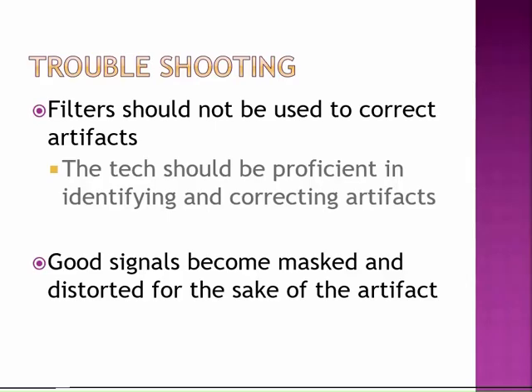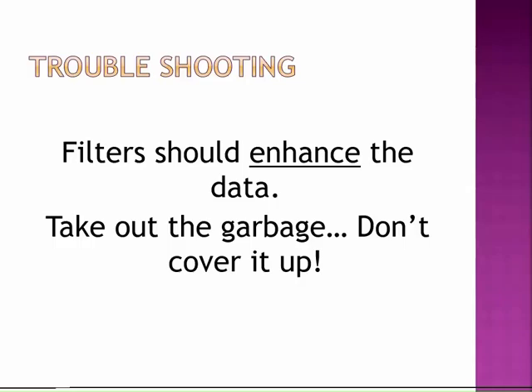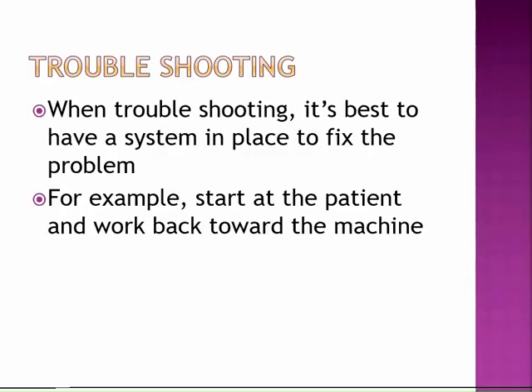Filters, you need to be able to identify and correct the artifacts. Ideally, filters are there so that we can use them if we need them, especially if the situation calls for not waking a patient up, trying to let them sleep as much as possible. But for the most part, you really want to make sure the filters only enhance the data that you're recording and they're not just making it look pretty. You're not gussying up a toad. So you want to have good signals coming through to start.